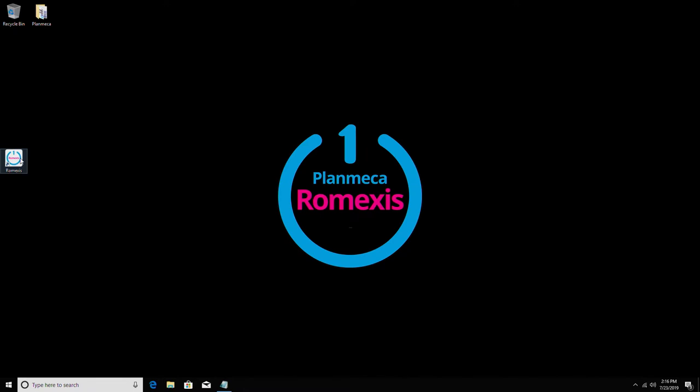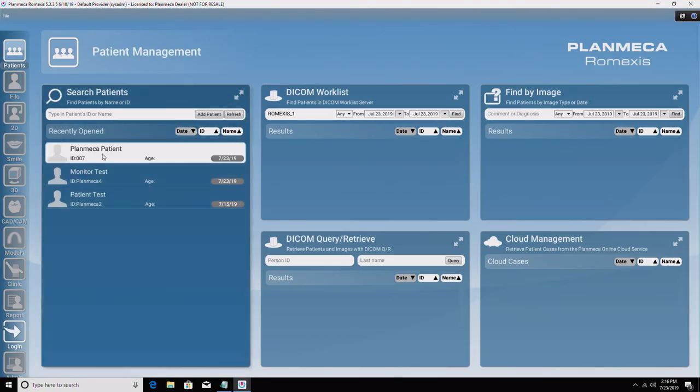To begin, prepare the imaging software until the computer screen says 'Waiting for Ready.' The appearance of this screen may vary depending on your software and version. If imaging in Planmeca Romexis, follow the steps below: open Planmeca Romexis and select the appropriate patient.